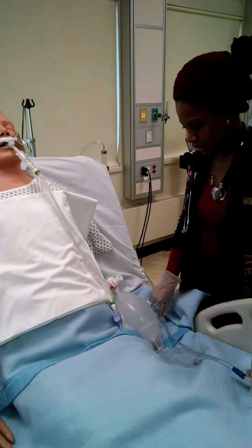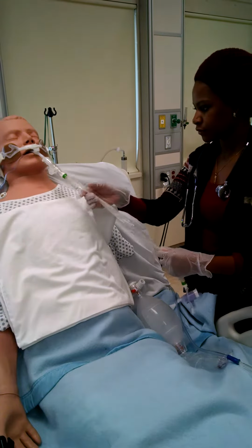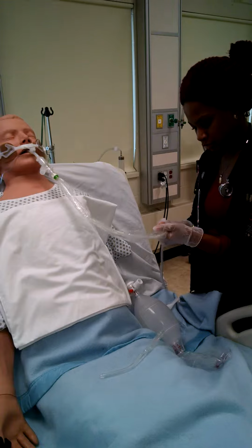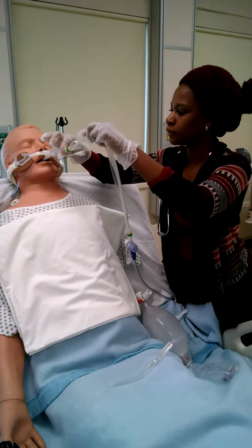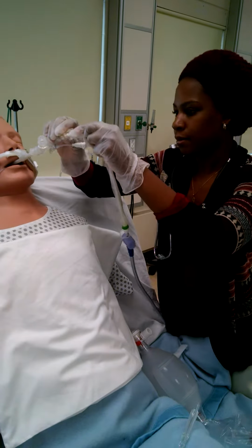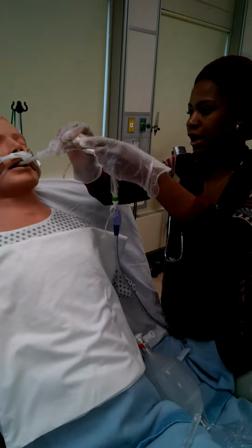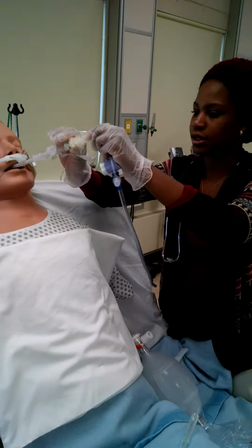Now that I've done that, I will go ahead and suction. And I would also, before this process, pre-oxygenate the patient with my manual resuscitator. And if the patient's on a vent, then I would just push the button for oxygenate.